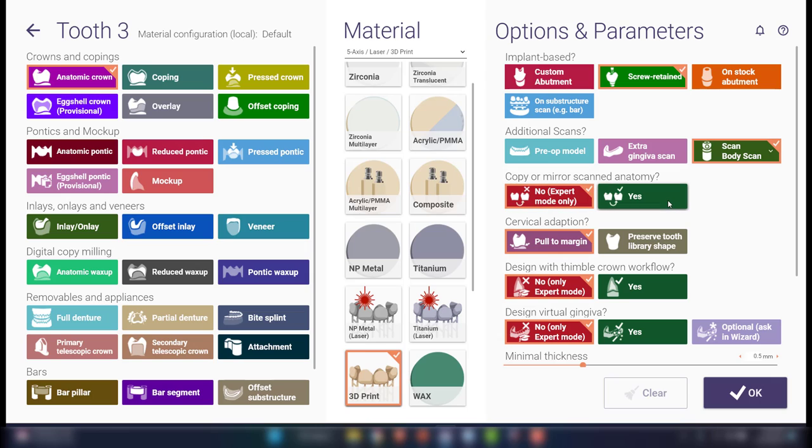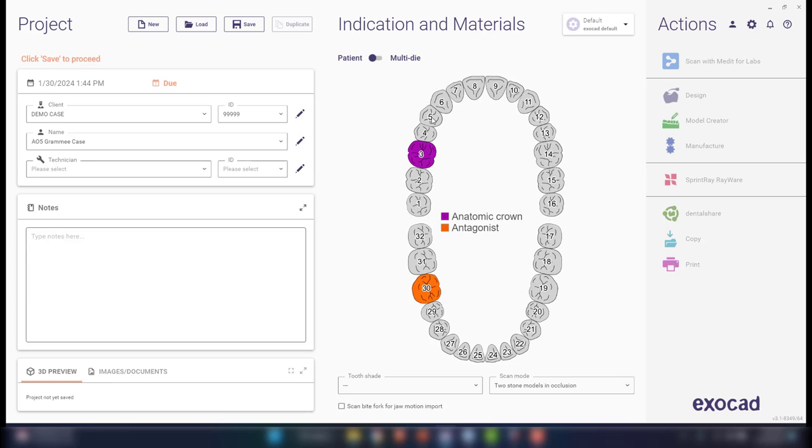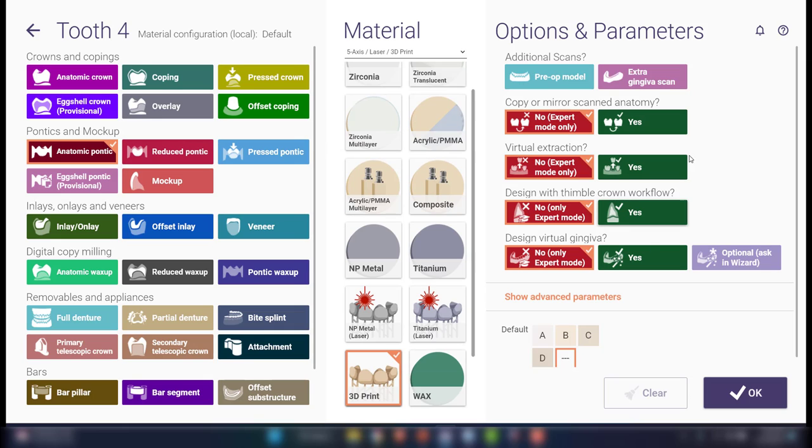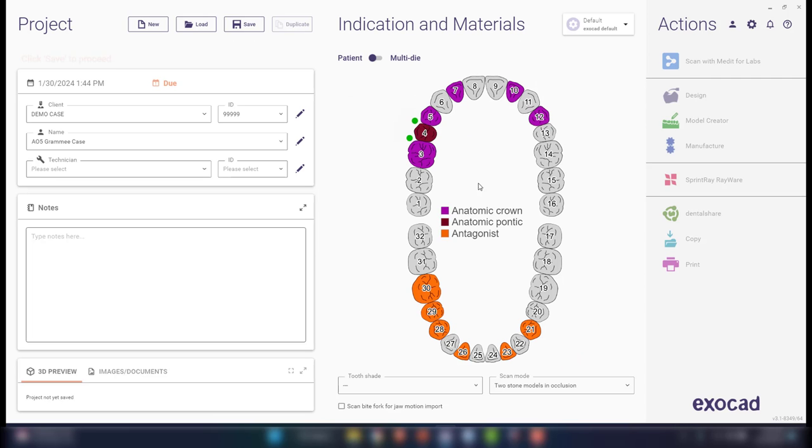Scan body is going to be in the main scan, and then we'll click OK, and then hold Control, and I can indicate what other teeth are going to be the implant sites. And then for the pontic sites, I'm going to do anatomic pontic. Again, just do it for 3D printing. We'll leave all of that as is, and then we'll fix these other pontic sites to match. And then we want to splint everything together, so we're going to splint all of these sites. All right, so save that, and then we'll launch the CAD program.